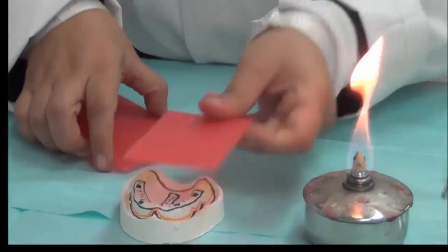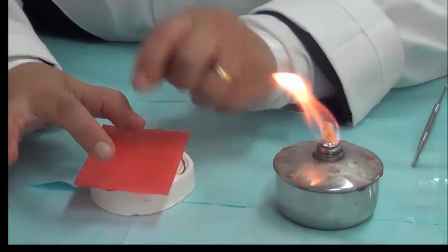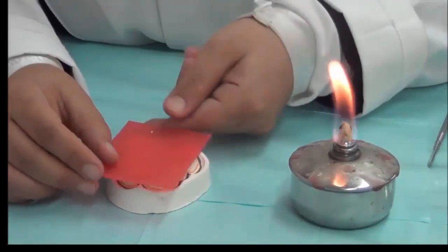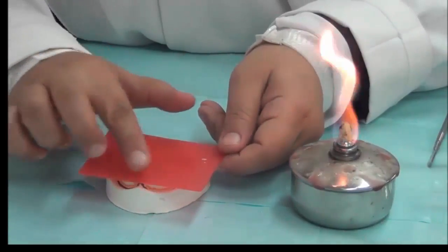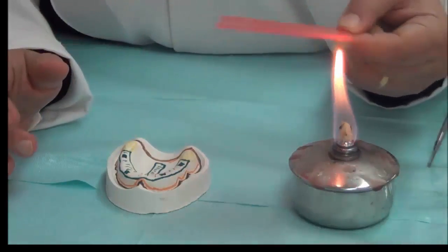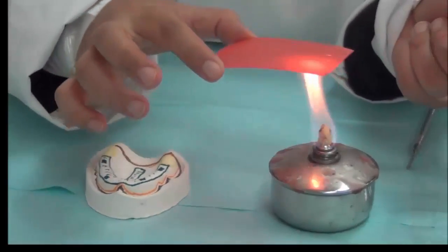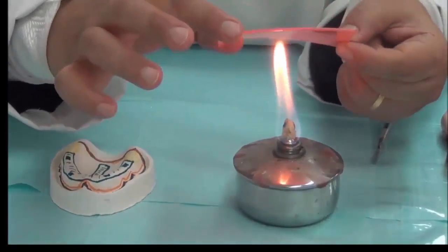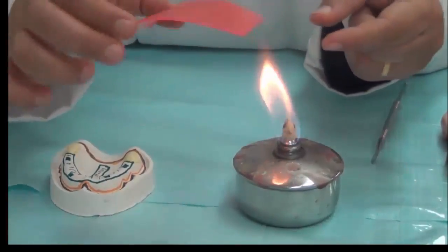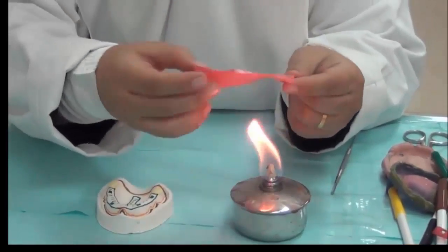And we need to adapt this to the cast. Like this, it's a bit firm and solid. We need to make it soft enough to adapt it to the areas we have drawn. So we're going to use our flame. This is where we ask you please to put on the flames on your benches carefully and make sure that all fire safety regulations that have been given to you in the lab are followed.